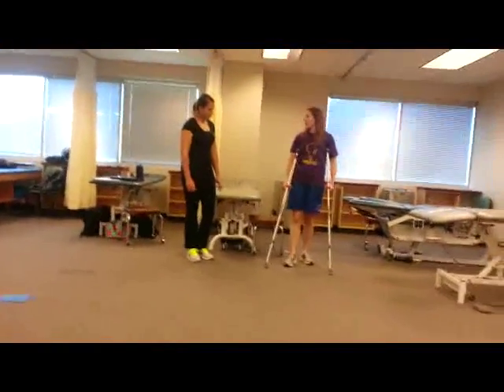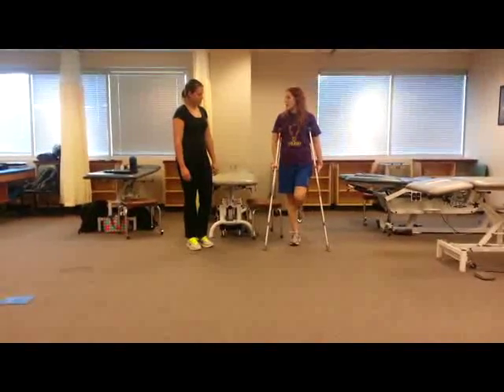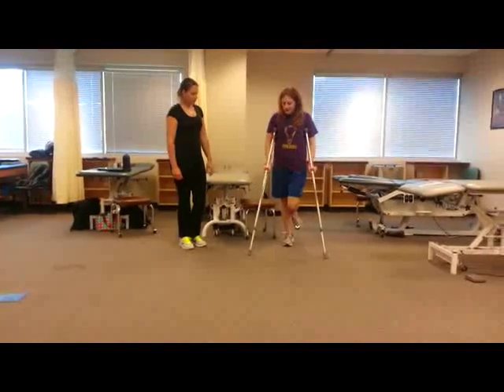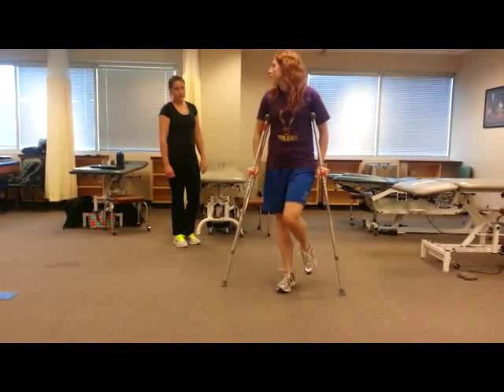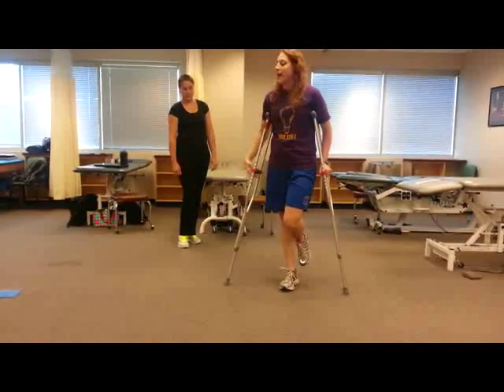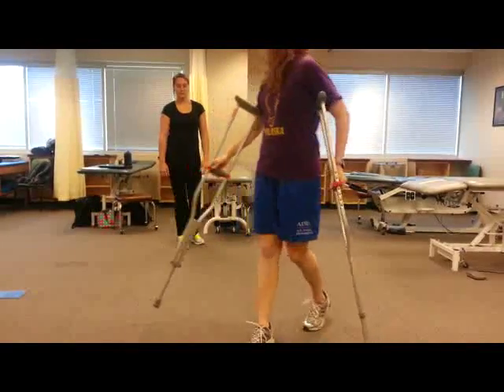With a three-point gait, this is kind of how we commonly see crutches used. If someone's non-weight-bearing on their leg and can't put weight down, they'll do the crutches first and then their leg. Crutches, and then their leg. At first, you want to just teach them to go right to the crutches like this. Once they get good at that, they can start to swing through and move a little bit faster.